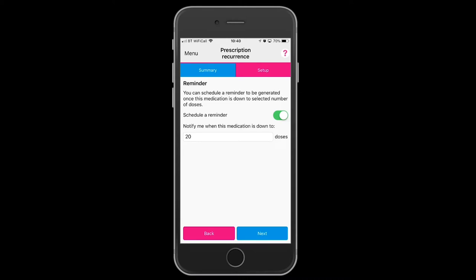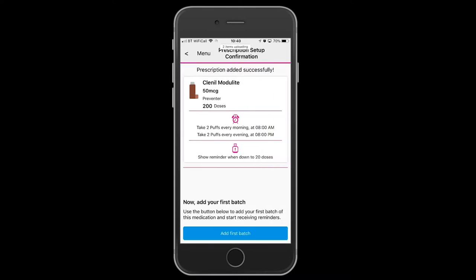There is the summary of the schedule of the Clenyl Modulite, and a reminder that you will receive when you're down to the last 20 doses.